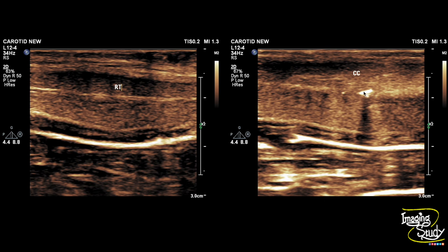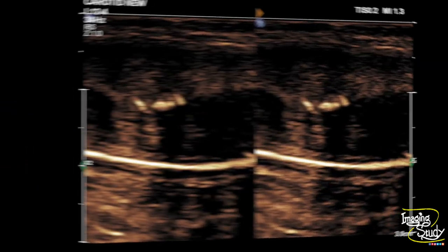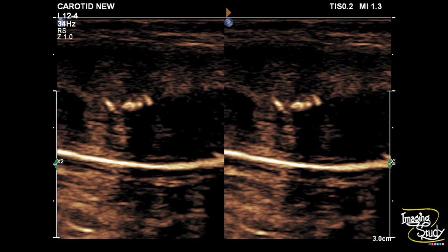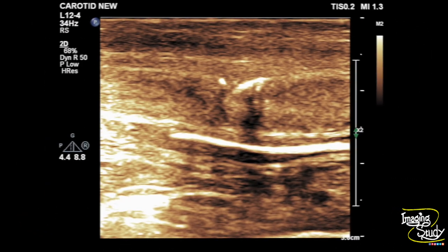On the right image you can see the calcific foci within the tunica albuginea casting faint acoustic shadow. Another picture with segmental calcified plaques suggesting Peyronie's disease. Another view showing the tunica albuginea with calcified plaques within.